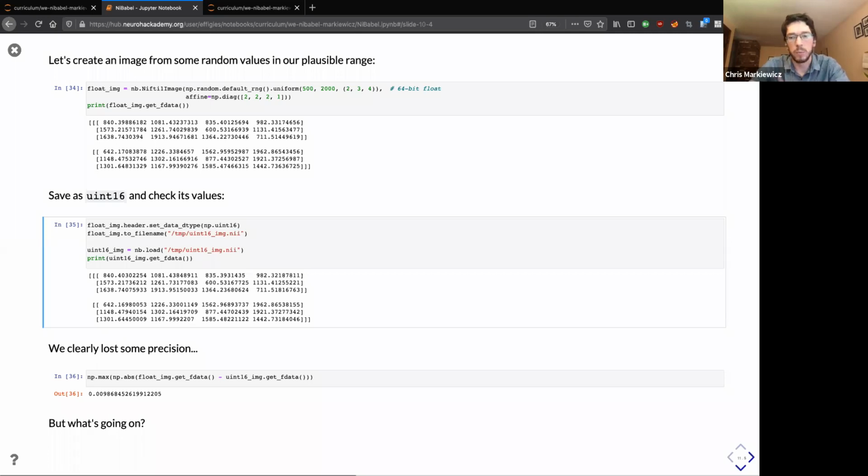So it's a question of how much do you care about not modifying the data versus how much do you believe those extra bits of precision. If you're operating as in float32s or float64s, there isn't enough information coming off of the scanner for you to really believe anything but, say, the first 12, maybe 16 bits. So this can be a very useful place to save space without losing interpretability.